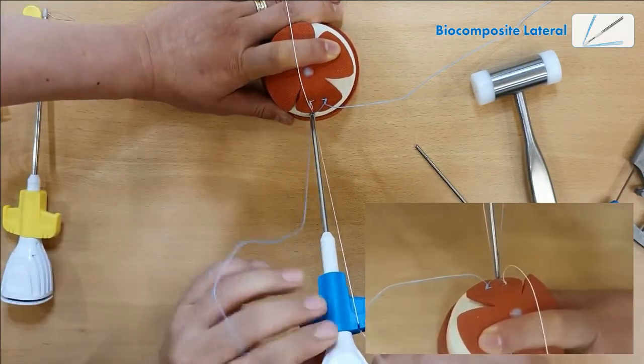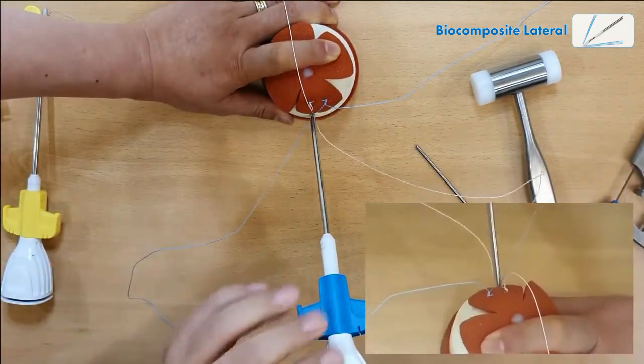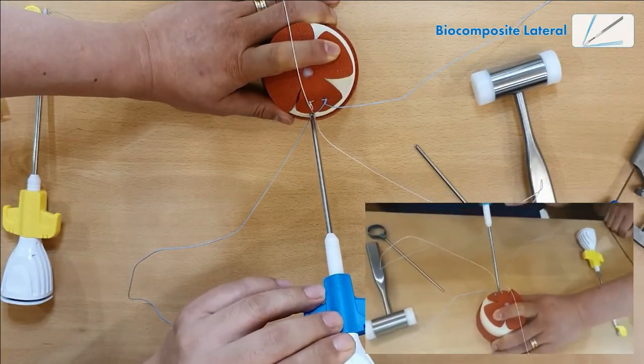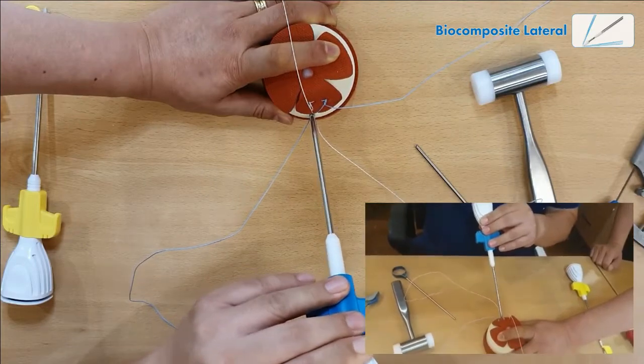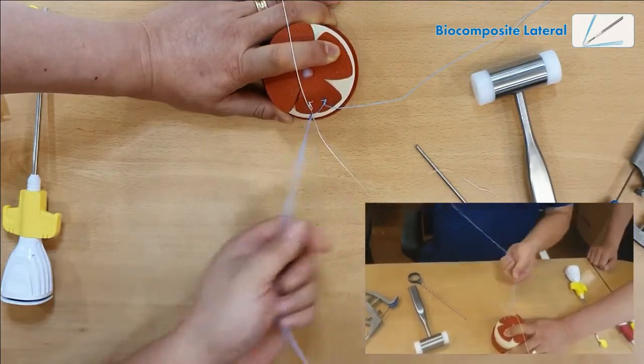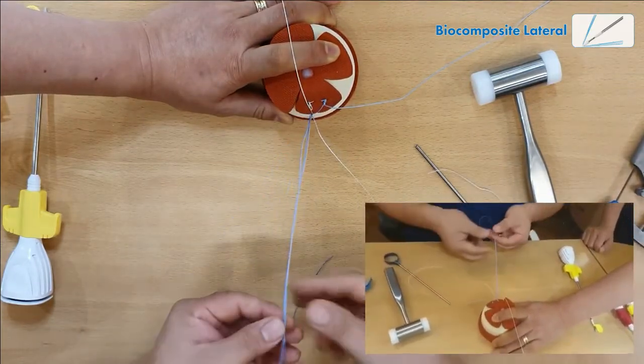Now, it's done. Just remove the fiber wire and we have extra fiber wires on the top. Remove that. Now, we are done with the first lateral anchor.